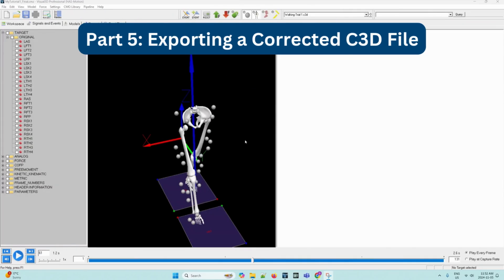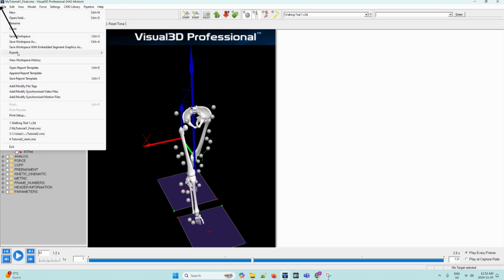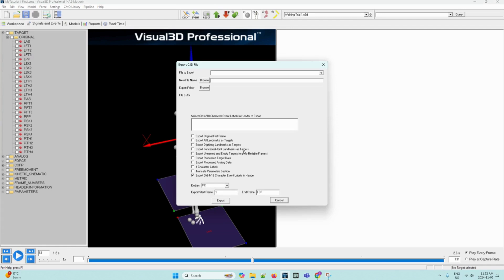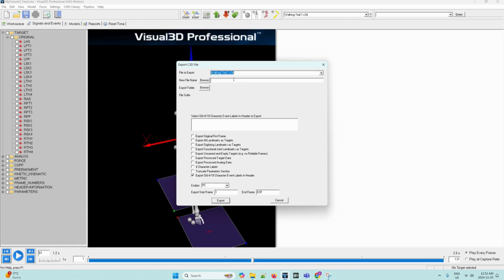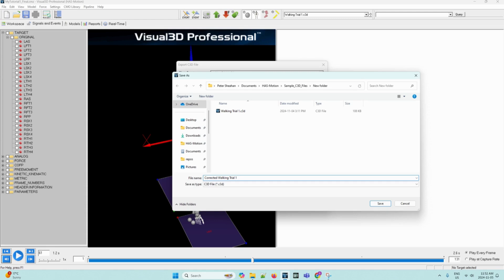Now that we have made a correction to the C3D file, we can export it. We can navigate to the File menu, click on the Export subfolder, and then click on Export C3D file. This will open this dialog box. We can click on Walking Trial 1 in the drop-down menu for the File to Export box and then click on Browse next to New File Name. From the Save As dialog box, we can browse to the location where you store your files and then enter Corrected Walking Trial 1. This will also save as a C3D file.